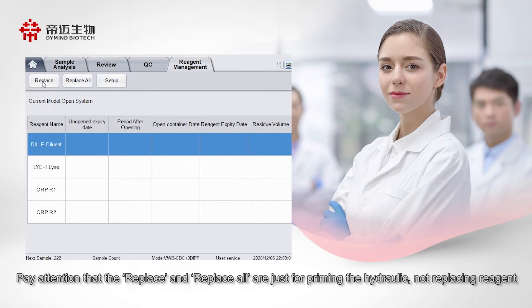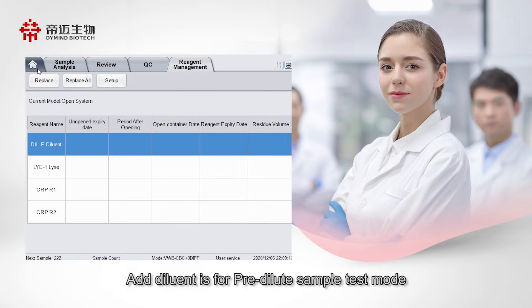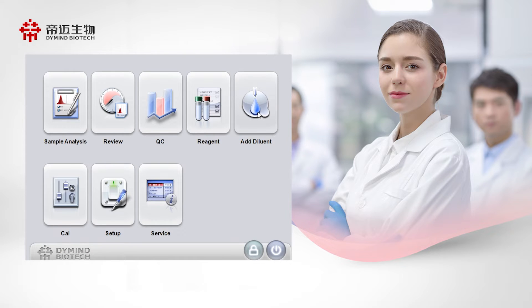Please note that Replace and Replace All are only for priming the hydraulic system, not for replacing reagent. Add Diluent is for the pre-dilute sample test mode.